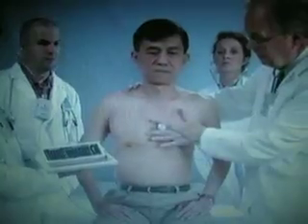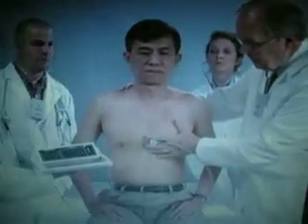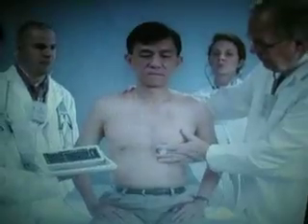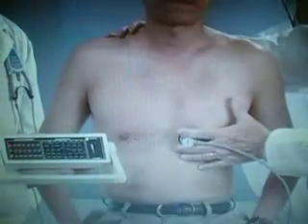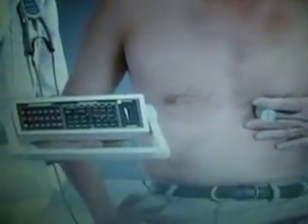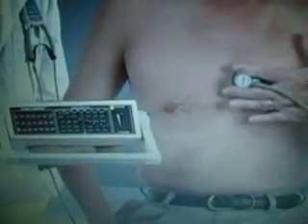Battery or line operated, the Simulscope may also be used for classroom teaching and also has been effective in telemedicine applications. Also, the patient's sounds from the Simulscope and ECG can be stored and displayed on a laptop computer screen using the Step View digital recording system software. This software will display the sounds as they are being recorded to provide a library of sounds that can be played back later for studying and teaching.